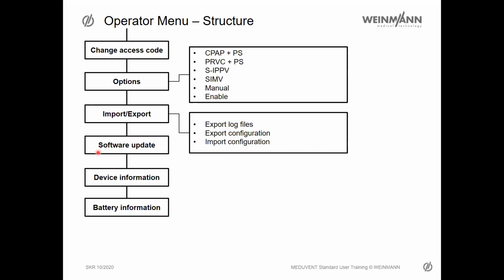You can make a software update. It's very important that the update software is on the highest level of the SD card. So don't hide it somewhere. It has to be on the highest level of the SD card.